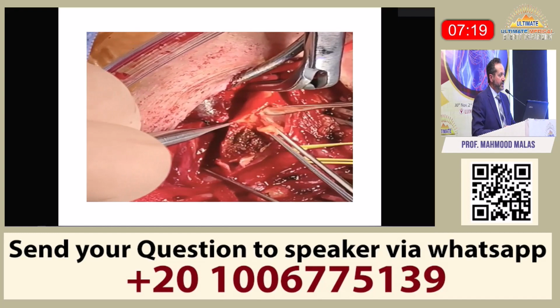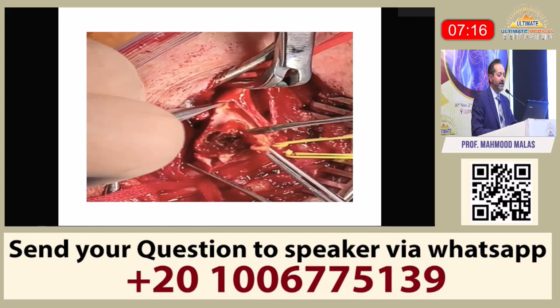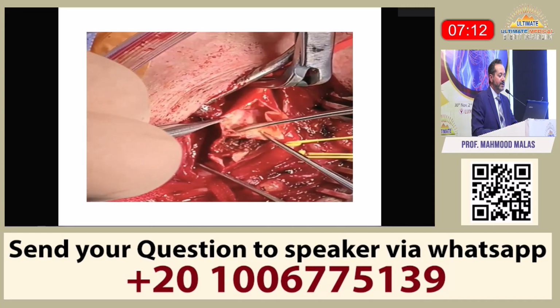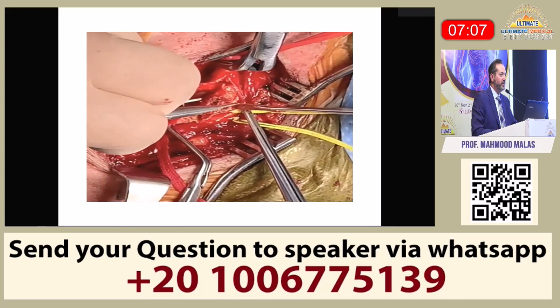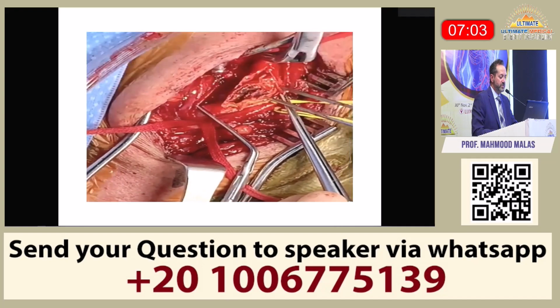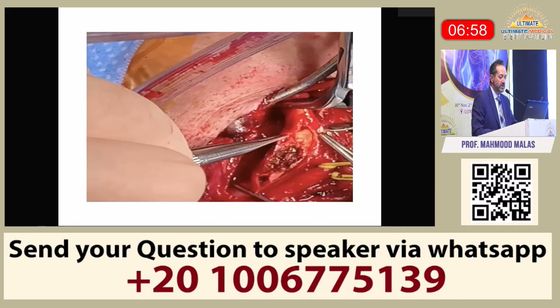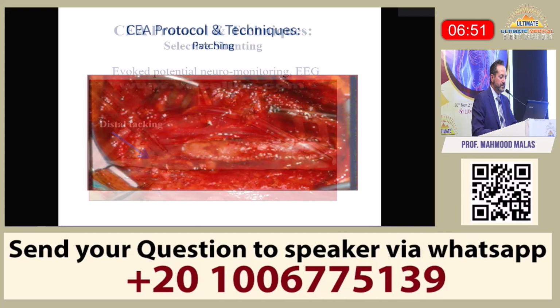Why do we love this procedure so much? Because there's nothing more gratifying than pulling that plaque, with this atheroma that you see, the intraplaque hemorrhage right there. You essentially know that there are not one, not two, not three, not four, there are like 6 randomized trials showing that you're going to reduce the risk of stroke when you do carotid endarterectomy. And then you get a beautiful artery like this, and then you patch. Most vascular surgeons patch.